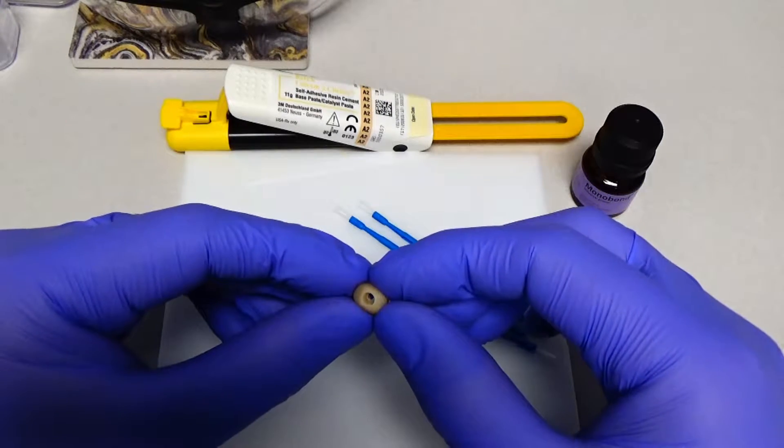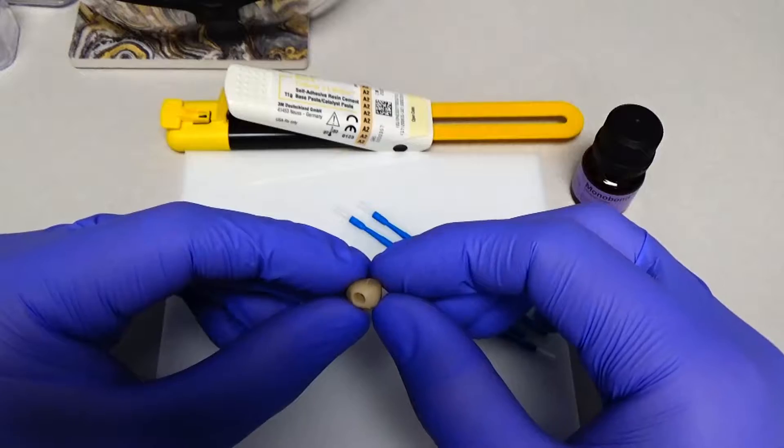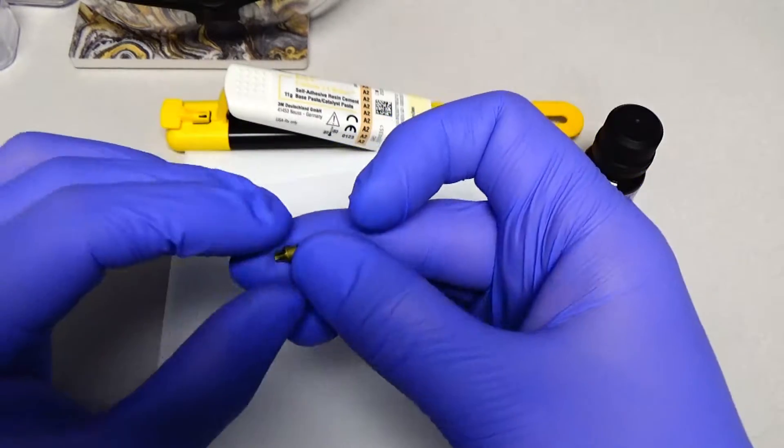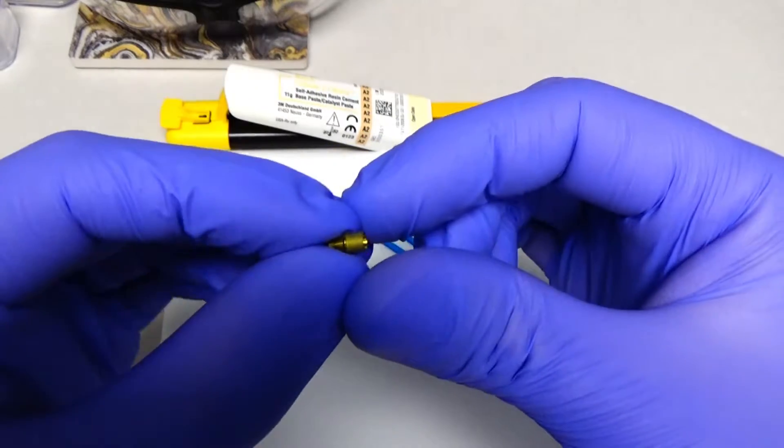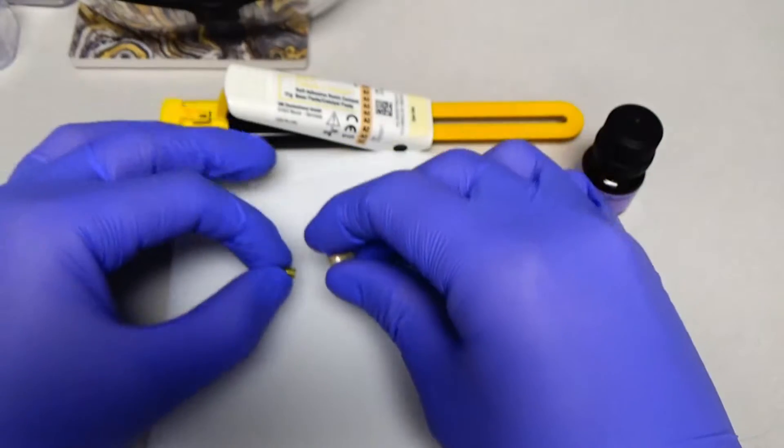And there's literature that says which size particle and which psi is optimum. The DESUSA comes pre-etched, and you can kind of see that matte surface there. It's not shiny, and so this is etched as well.